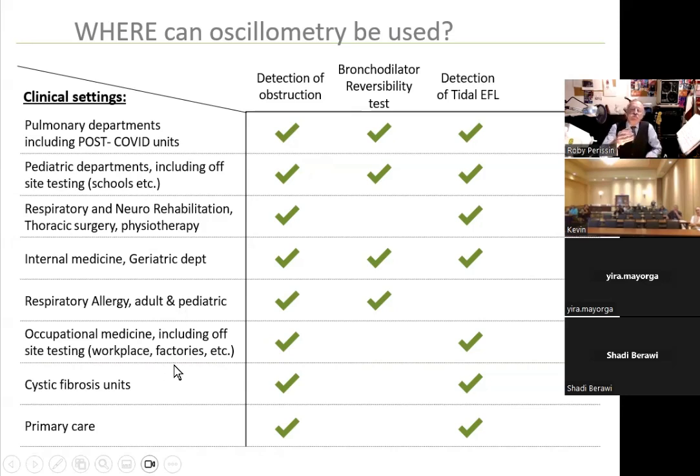And here is where the patient comes in referred by his boss. Maybe they work in a hairdresser or in a body shop and say, I can't breathe well because I breathe it all day, funny stuff. Well, a lot of these patients don't want to do a spirometry. And so you say, no problem, sir.